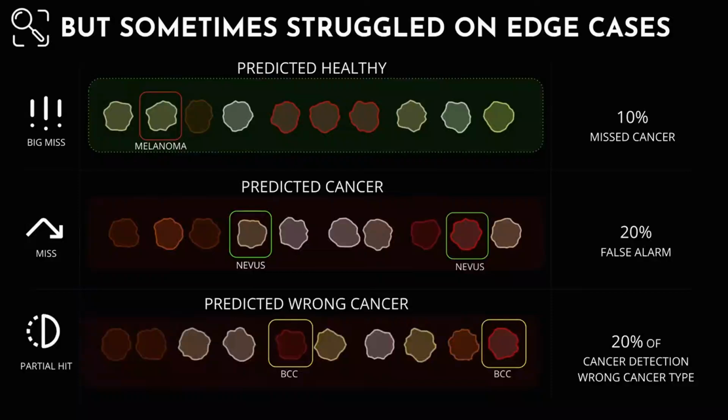The third one, which is a minor one, is that the model doesn't pick up the correct cancer type. So say the model, even if it picks up the cancer risk, in 2 out of 10 chances it's going to pick up the wrong cancer types.